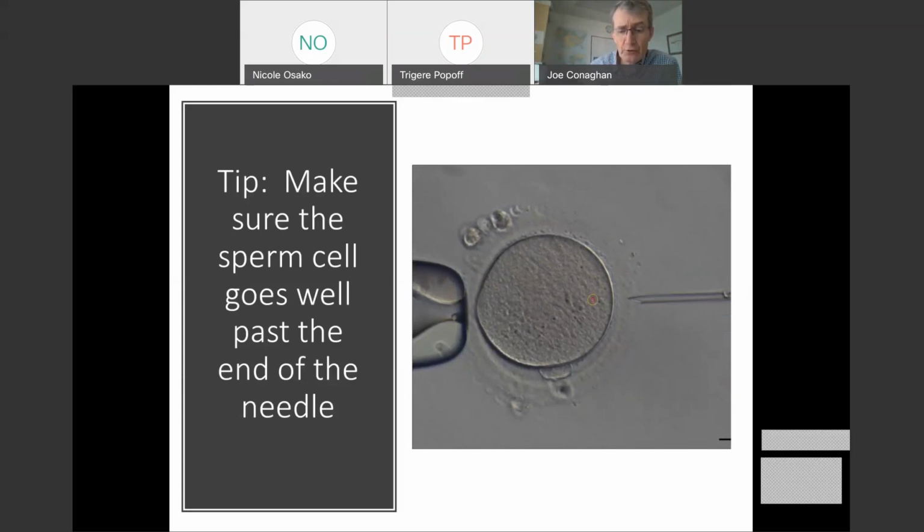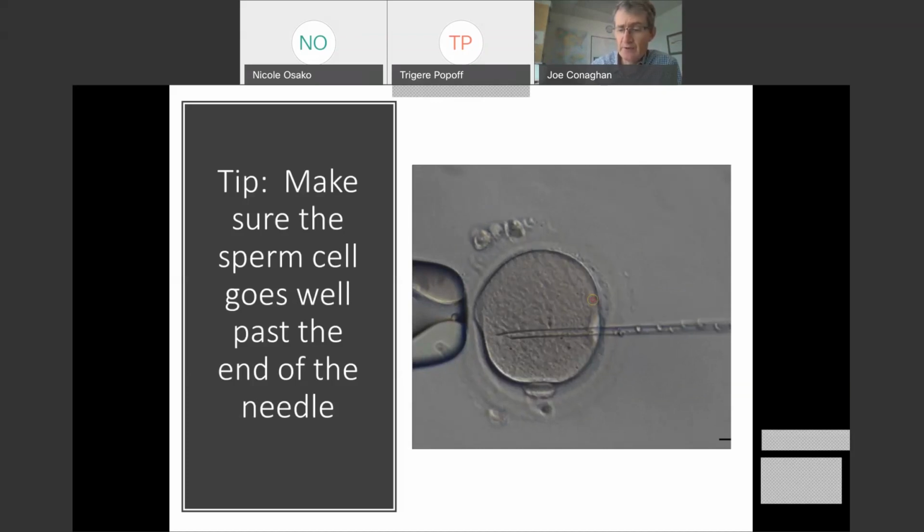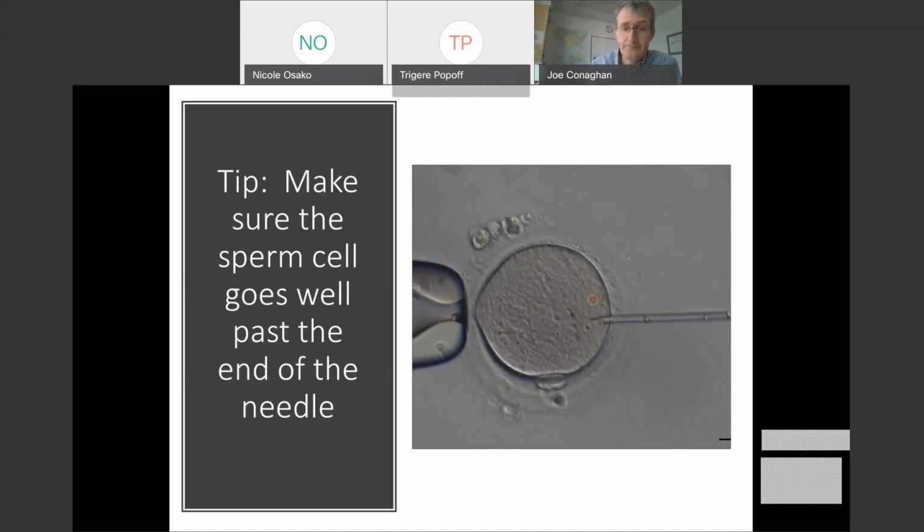So always make sure with your ICSIs that you are confident that the sperm is definitely in the cytoplasm and that it has shot out of your needle and gone way past the tip of the needle, right? That might be the most important tip that I'll give you today.